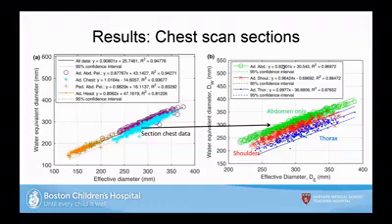Now the shoulder data. The shoulders typically have the same water equivalent diameter as the abdomen, but because they are broader, the lateral dimension is larger. So the shoulders have been pushed more to the right. So there's a shift there. Now the thorax region, as I expected, these values are a lot lower than the abdomen only.